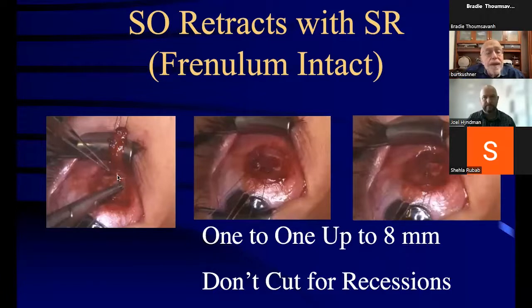And I just put a suture in the superior oblique just as a guide. And I pull the superior rectus up to the insertion and measure the length of this. There's a reference knot on the suture of the superior oblique. And then I'd let the superior rectus hang back 6, 7, 8, 9 millimeters and see by measuring how much the knot moved on this suture in the superior oblique, how far the superior oblique went back with the superior rectus.